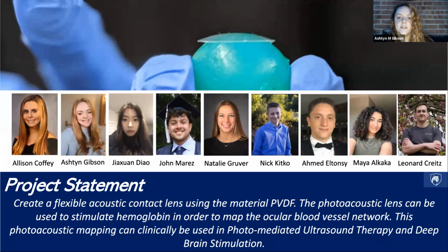An alternative design for our product was influenced by using lithium niobate as a material for the contact lens. This material was eventually ruled out because PVDF has the superior photoacoustic properties, flexibility, and a more reliable fabrication process.